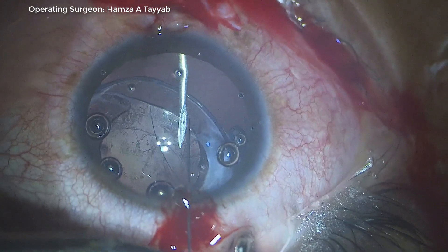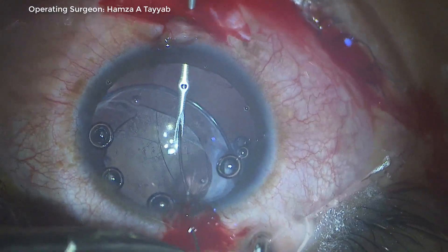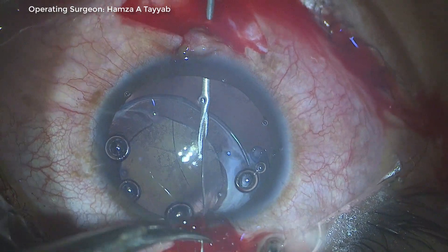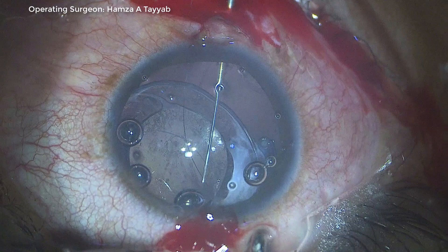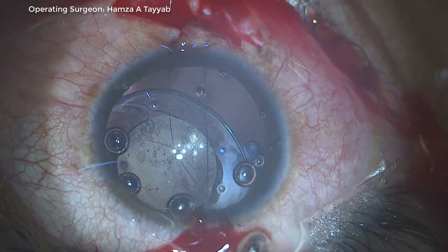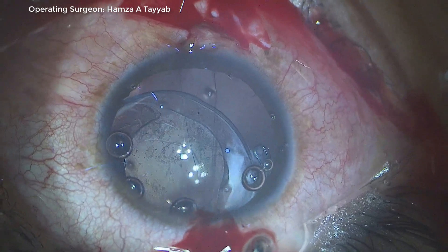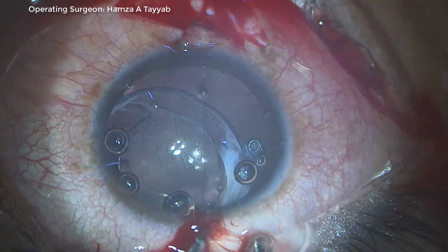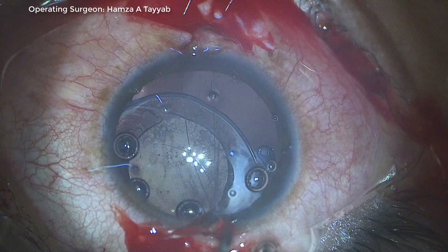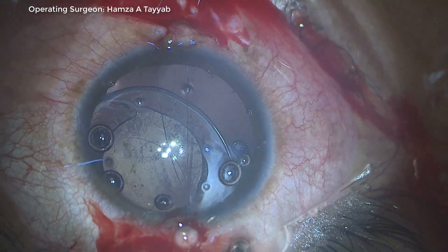I thread it carefully, turning the bevel down to thread it into the 26-gauge needle. I face difficulty because the bevel is not fully downwards; however, I am successful in threading. As I pull the loop, I have accidentally — the second 10-0 needle accidentally took a bite of the corneal stroma.